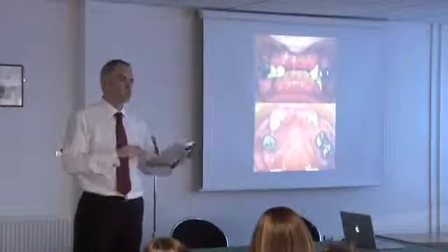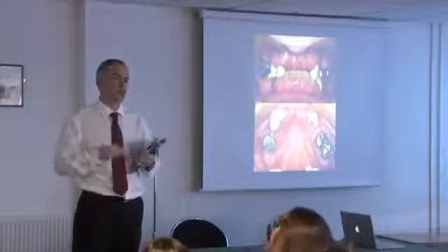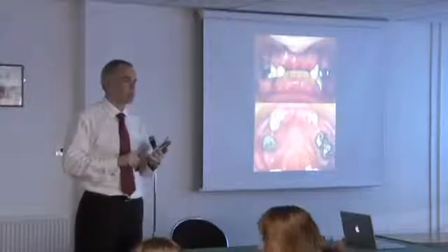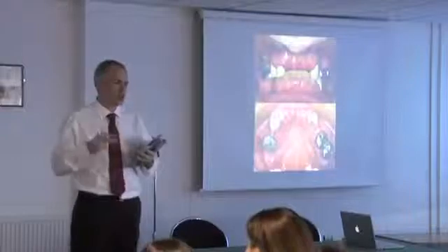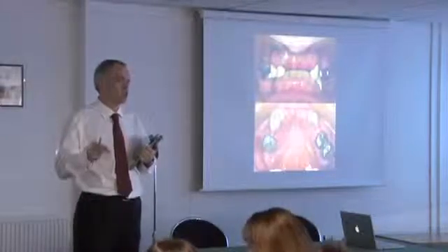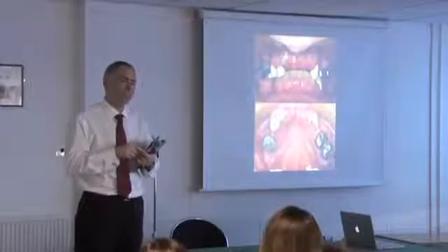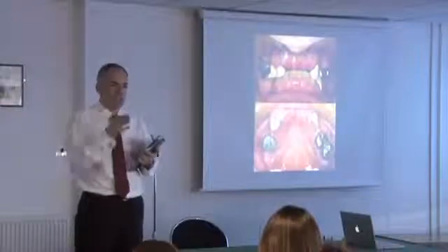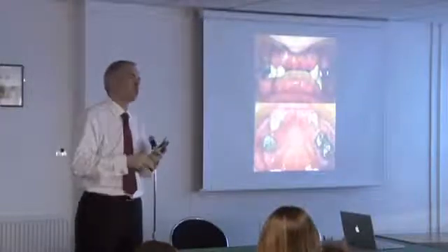And the reason it doesn't work is because you've lost control somewhere down the line. Because by and large, the same technician isn't doing the crowns that's doing the denture. And you've lost the aesthetic goal. The aesthetic goal has been lost somewhere in the mix of the crowns being made or the denture being made. And you need to get control of that at the beginning. And that's your job, it's not the technician's job. That was the revelation to me. It's not find one technician to do it all. It's take control over what you're trying to do.